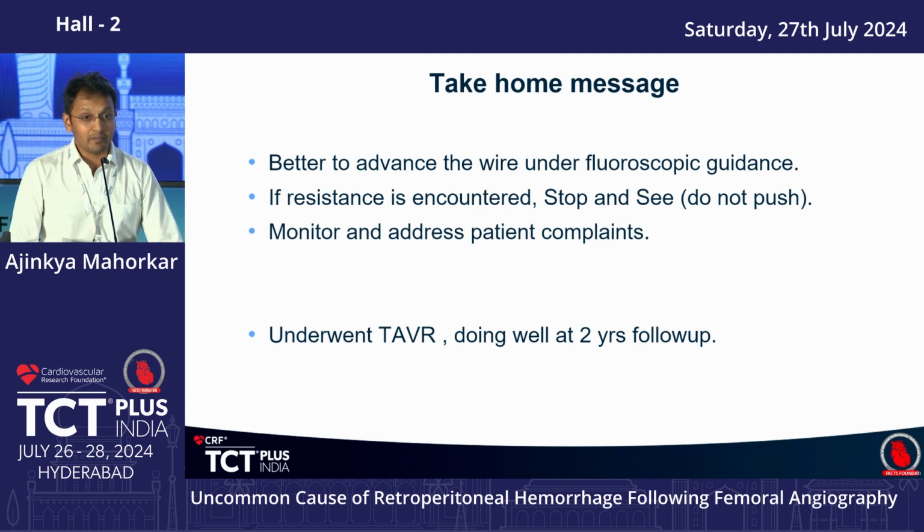So this is a very easy step we usually miss during our procedure, that we don't advance the wire under fluoro guidance. And whenever that happens, cases like this will happen. So it is always better to advance the wire under fluoroscopic guidance, and if there is resistance, stop and see, do not push. And retrospectively we thought that for the first hypotension the patient had, we gave her IV fluids and waited for 1 more hour. I think that time could have been saved if we had been more vigilant.